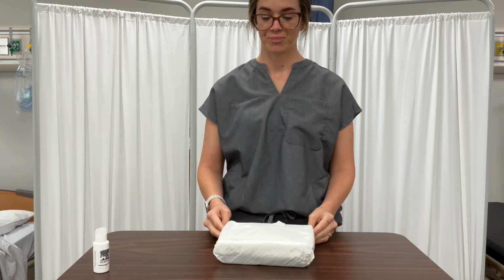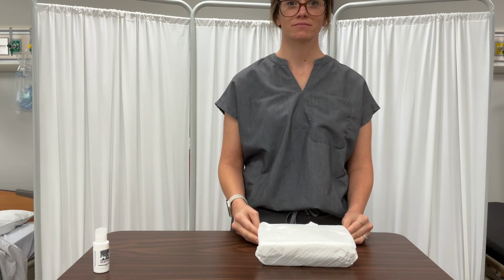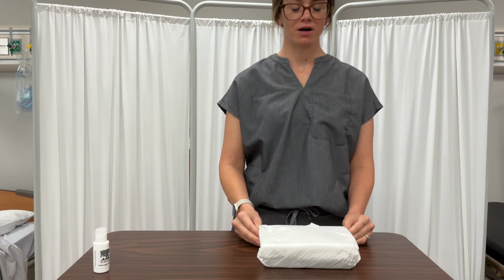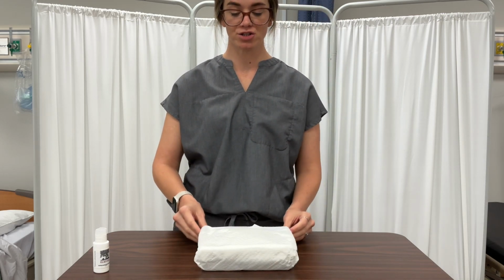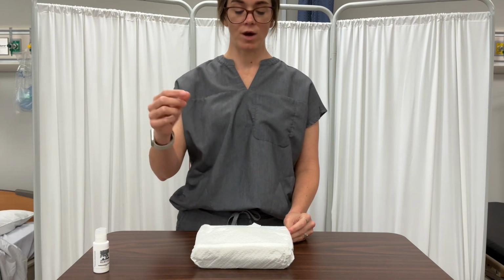Okay, so she's going to start by grasping the outermost flap away from her body, keeping her arms stretched and away from the sterile field. Okay, if you saw me turn it, it's because it was facing this way. So make sure your first flap should be going directly away from you.